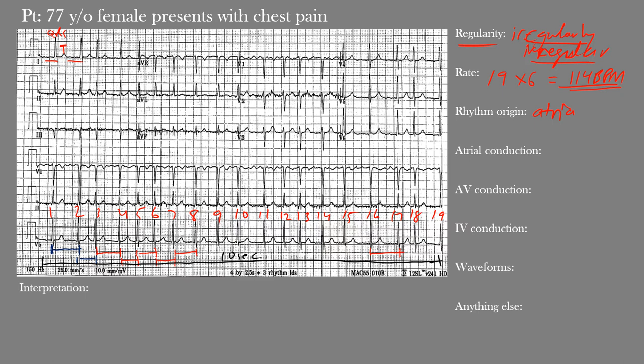For atrial conduction: we can't make out any P waves, and P waves represent atrial depolarization, so there is no clear atrial conduction here. For AV conduction: again, no clear P waves means there's no clear PR interval and no clear AV conduction. For intraventricular conduction: normal QRS duration is between 80 and 110 milliseconds, or about two to three small boxes. We can see narrow QRS complexes within normal limits — the QRS duration here is 84 milliseconds — so we have normal intraventricular conduction.